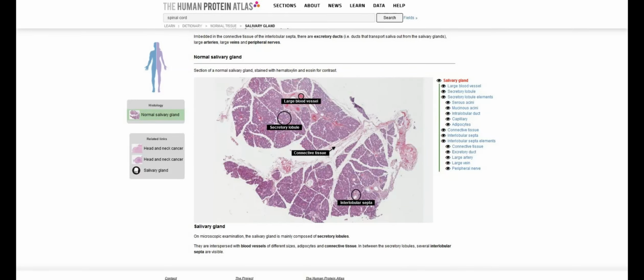In this lab, we will talk about three main types of histology for the accessory digestive system. The first of which is going to be our paired salivary glands. Now, these tend to be the trickiest structures for students to absorb. The reason for that is we have three types of salivary glands and they all look different under a microscope. And yes, you are expected to know those differences.